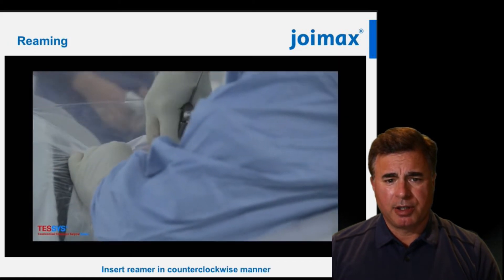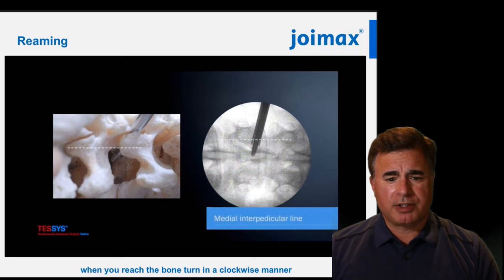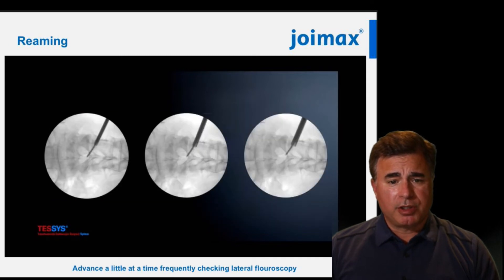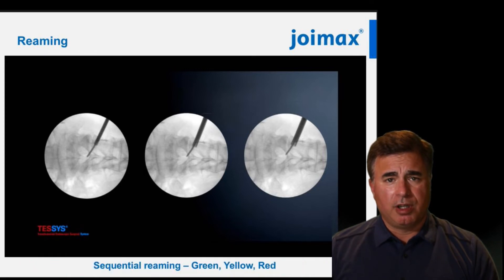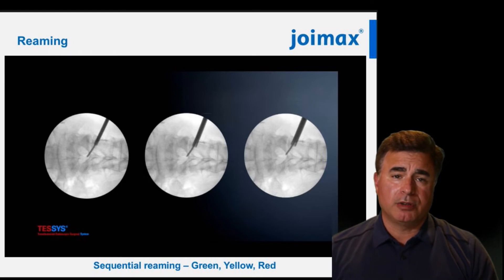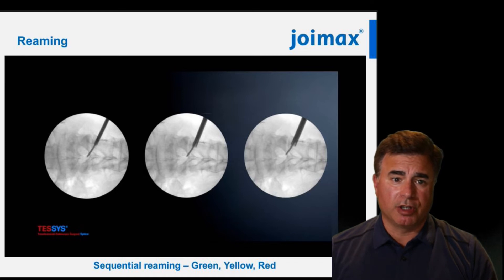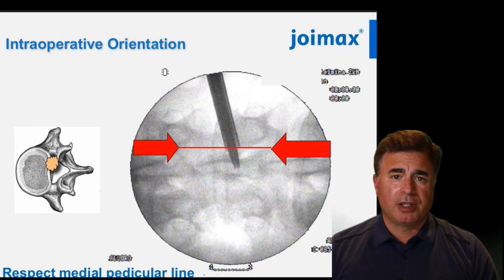Next, insert the crown reamer in a counterclockwise manner to avoid injuring the soft tissues. When you reach the bone, turn your reamer in a clockwise fashion and advance a little at a time, frequently checking fluoroscopy. The goal is not to go beyond the medial border of the pedicle — if you do, you run the risk of injuring the dura. The dura never goes more lateral than the medial pedicular line, so if you don't go beyond that line you will not injure the dura. This is why it's so important to have good imaging so you can define your medial pedicular line.